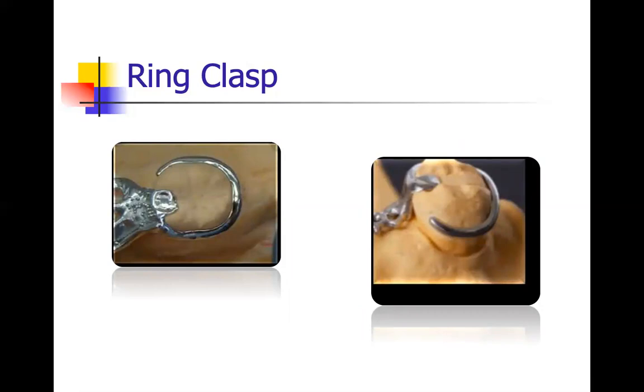The advantages of ring clasp are that it provides adequate encirclement, therefore excellent retention, with adequate flexibility due to increased length of clasp arm. So this was the advantage. The disadvantages include decalcification of teeth, increased occlusal table, and poor structure of clasp.